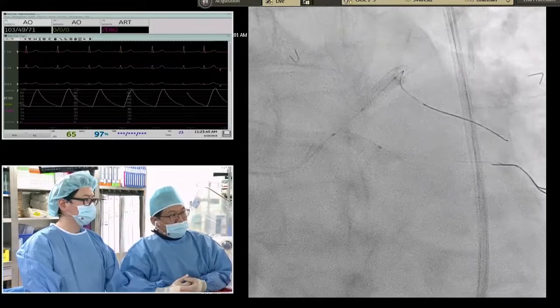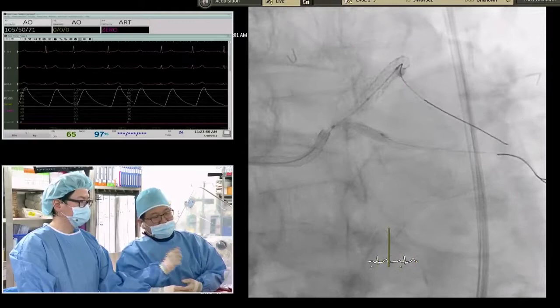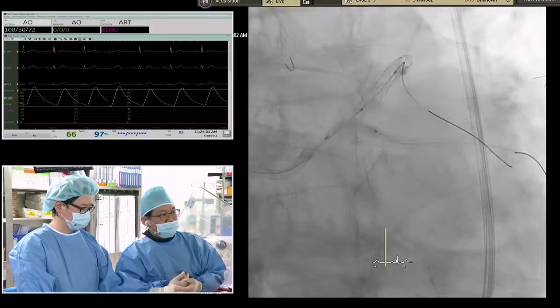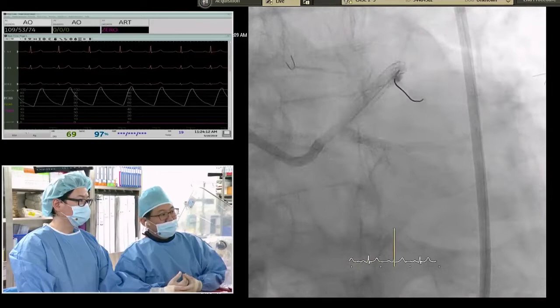I inflated the high pressure 20 up to 28 to open further the circumflex ostium stent. If there is some shrinkage, the rewiring is very difficult. So I open again. Next, again. This is balloon crushing. Crush the circumflex ostium by a 3.75 high pressure balloon. Yes, you can see the, yeah.